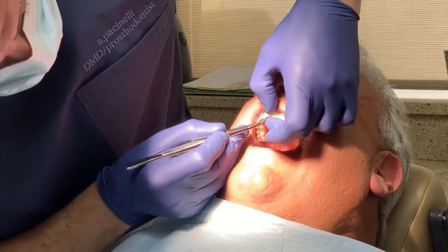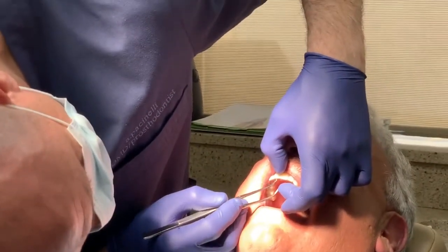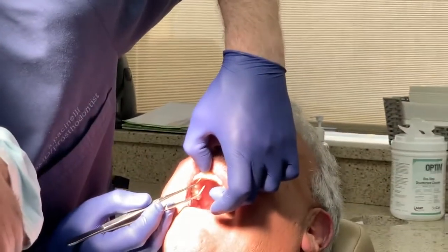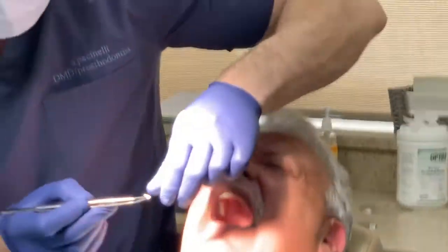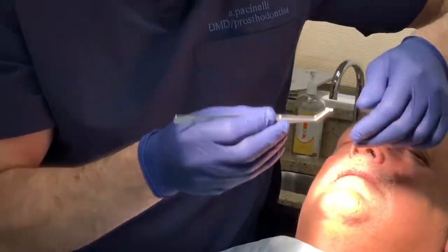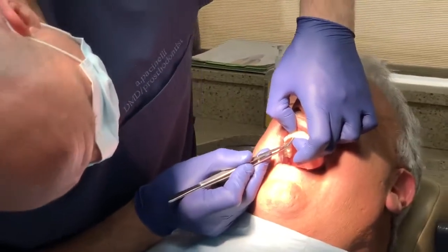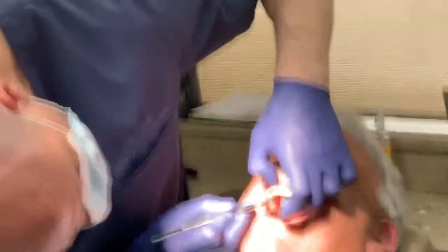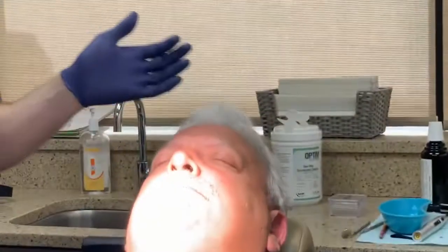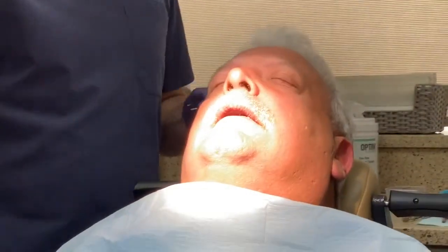Because it's just easier for me to see it, and some of the different color Teflon tape is thicker, so I don't have to roll up a whole bunch like I just did now. But if you're going to cover back over the Teflon tape, you want to use a white Teflon tape where it's emerging from the tooth, because cosmetically, if you have a different color Teflon tape, it's going to shine through.